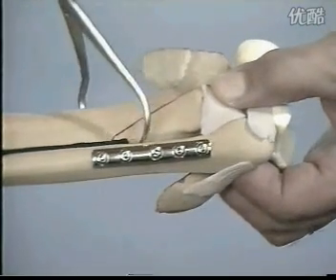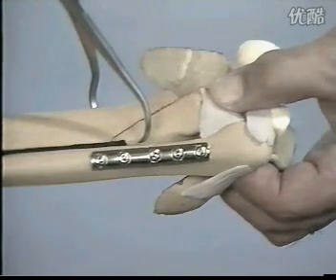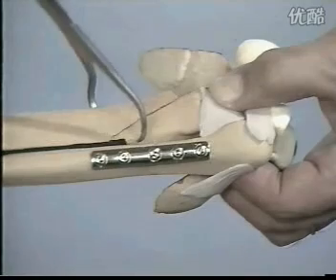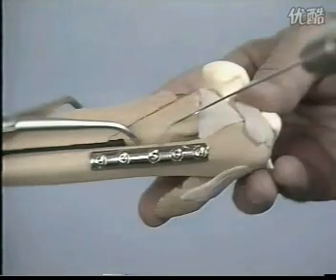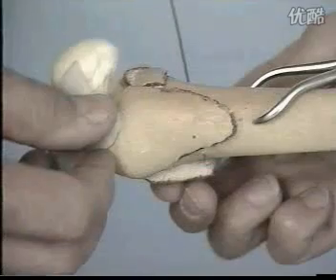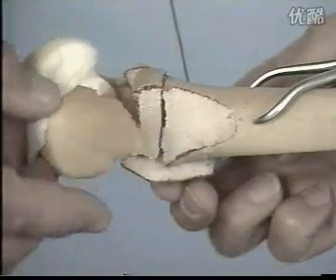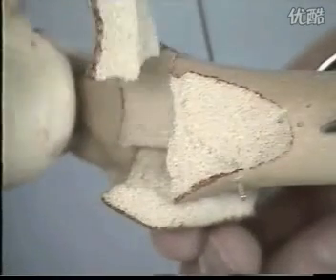The reduction of the tibial fragments begins anterolaterally. This fragment is connected to the fibula via the anterior syndesmosis. Preliminary fixation with a Kirschner wire. To reduce the dorsal fragment, it is sufficient to slightly push the impacted central fragment aside. We will not remove it.